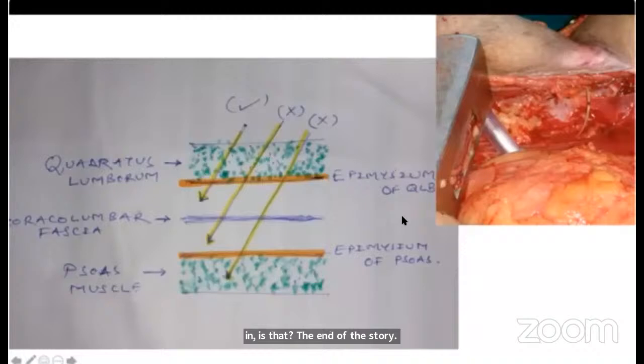Now, this was our QL3 catheter, and this was a case of open nephrectomy. As we can see, once the surgeon had made the surgical incision, there was a big rent in the thoracolumbar fascia, and our catheter is popping out in the surgical field. So where exactly should we deposit the drug?